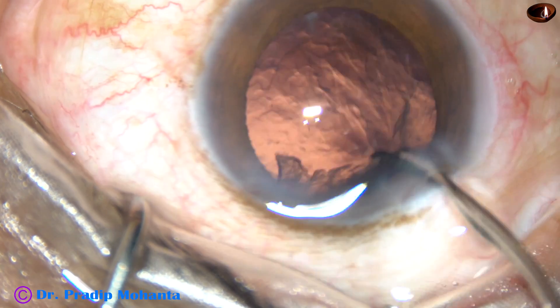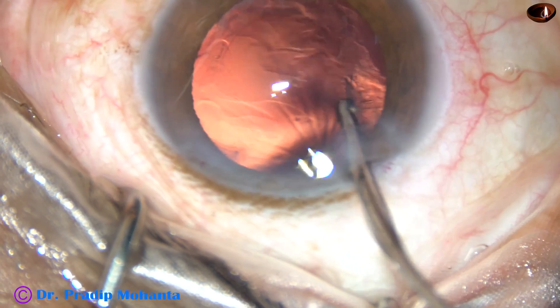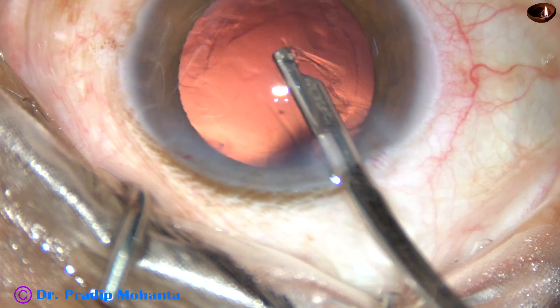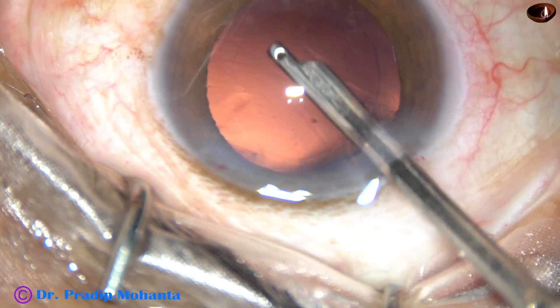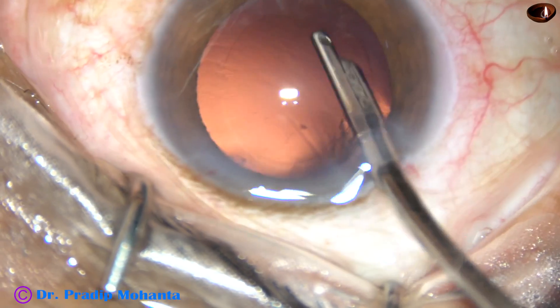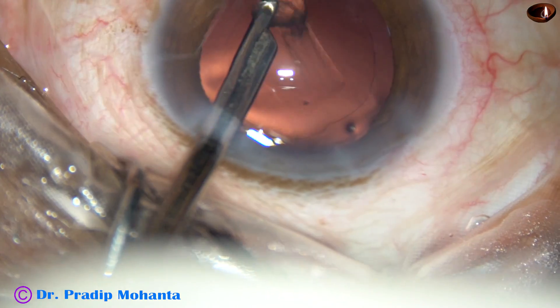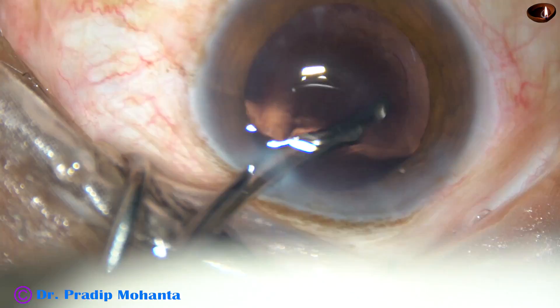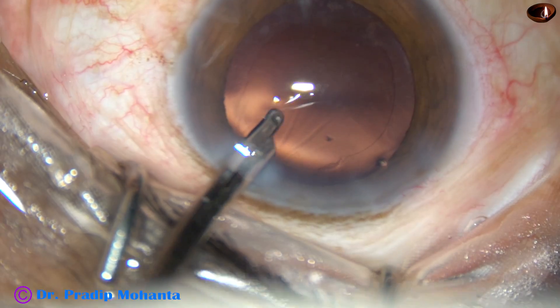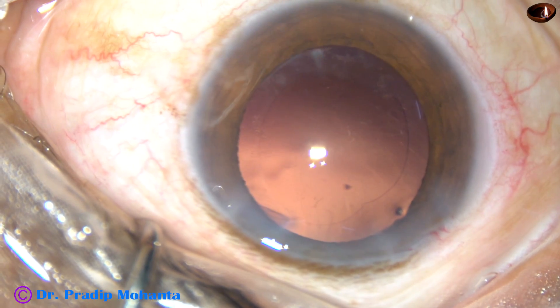The nucleus has been managed and now this is cortical cleanup. Cortex is very little in this case — a little bit of cortex at 10 o'clock and that is removed. I have made only one side port, so I am not using bimanual irrigation aspiration.